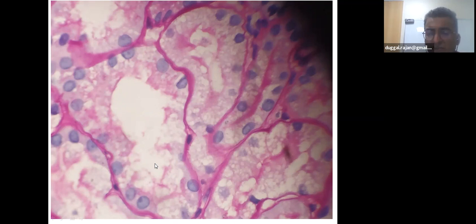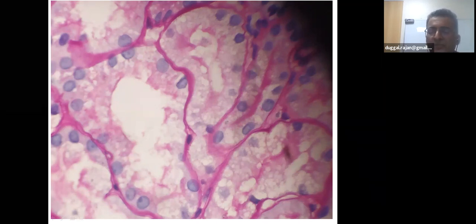The other thing I want to highlight is the tubules, whenever there is a nephrotic state, or sometimes in an ATN also, you see some vacuolization, and at places these vacuolizations look like isometric vacuolizations also. So we face this problem in transplant biopsy more, because in transplant biopsy sometimes you see these vague isometric vacuolizations which are actually not vacuolizations of CNI toxicity. Vacuolization is not a very specific finding, but yes, sometimes classical isometric vacuolizations are seen. That is okay for CNI, but otherwise some vague vacuolizations can be seen in any nephrotic state in tubules, in any form of tubular injury which is unrelated to CNIs.